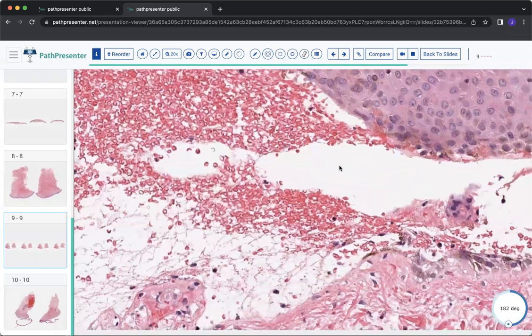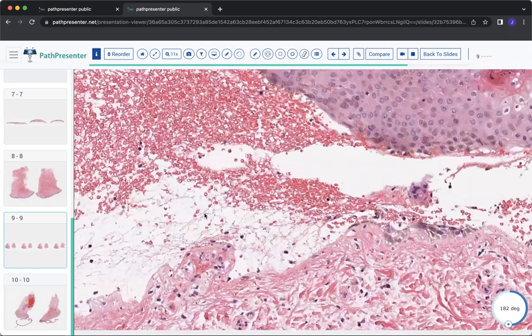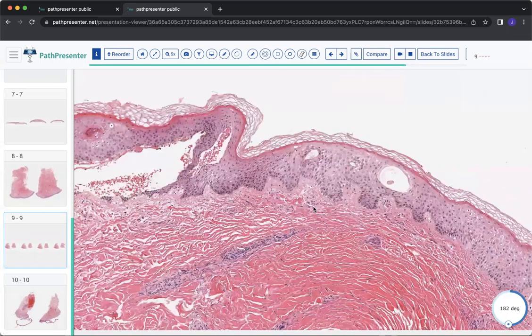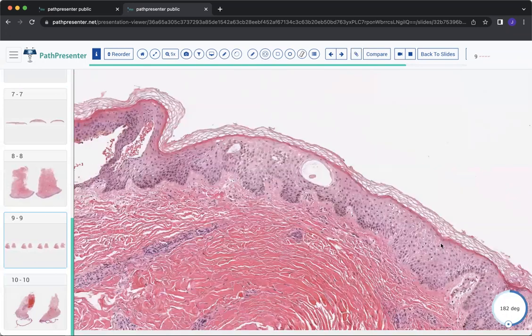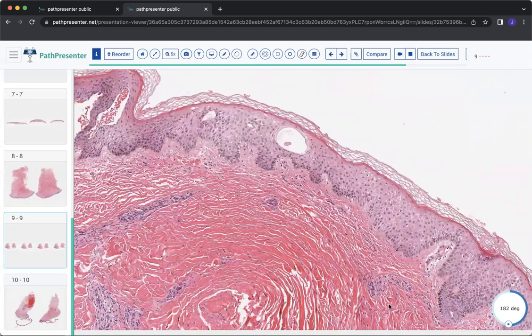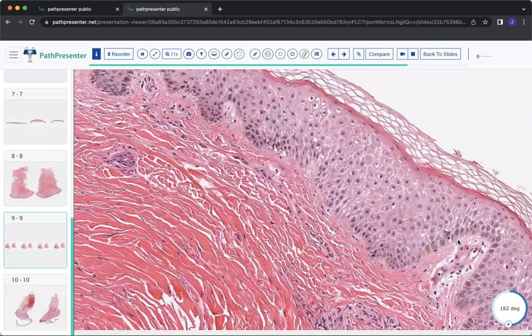So you need to do a salt split skin and look to see where the immunoreactants are localizing. So if you go perilesional and do a salt split skin, you're going to find that in EBA, which is this diagnosis, the immunoreactants are going to go to the floor of the salt split skin, because salt split splits it to where the collagen 7, which is attacked in EBA, stays on the floor of the generated bulla.